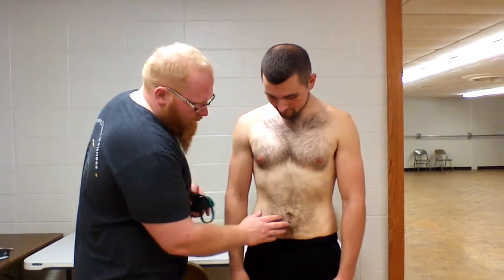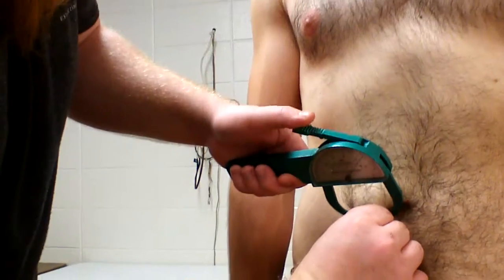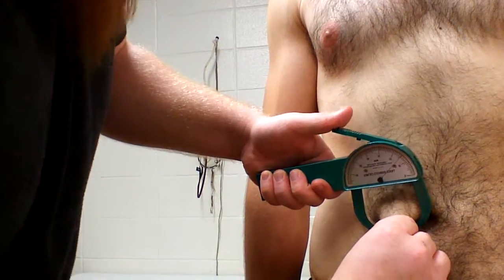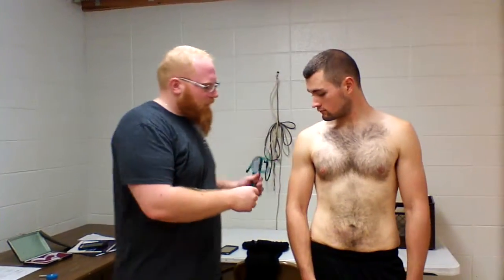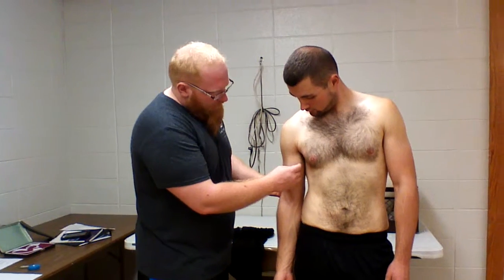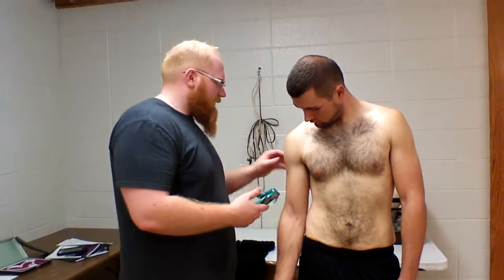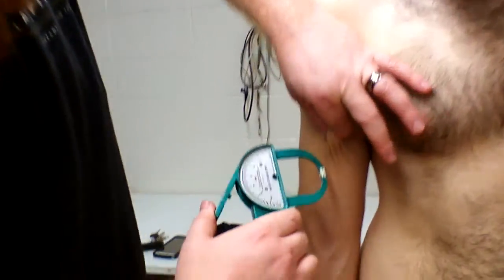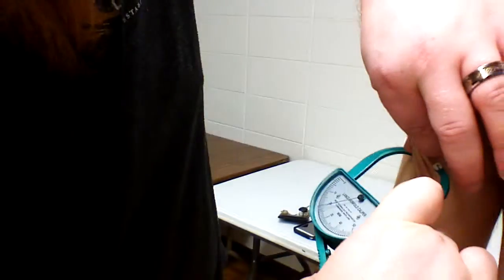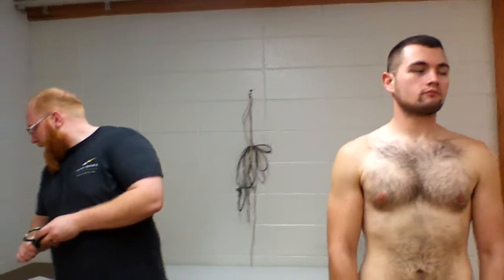Alright, next we're going to do the abdominal. This is a really easy one, just 2 centimeters over from the umbilicus. Okay. Next we'll do the biceps. This is a vertical fold. You want it right in the belly of the bicep, right at the max circumference. It's going to be about 1 centimeter above where you got the triceps at. Five. Okay.